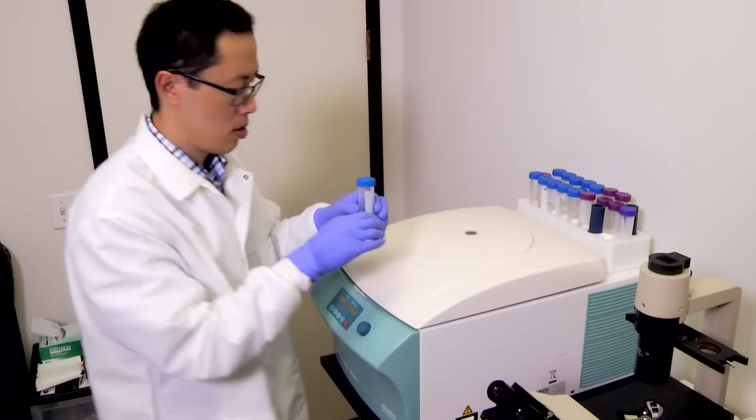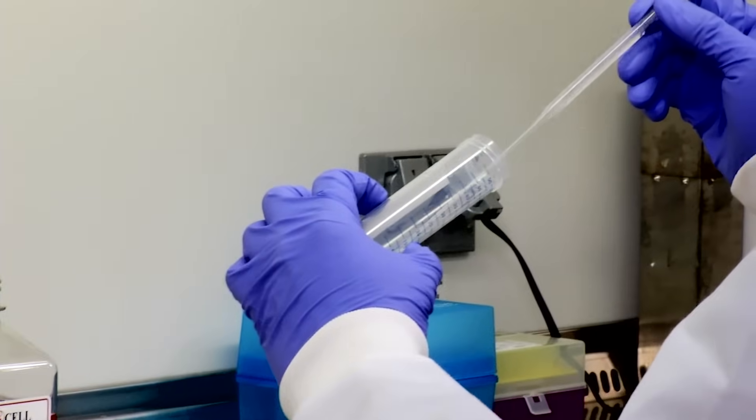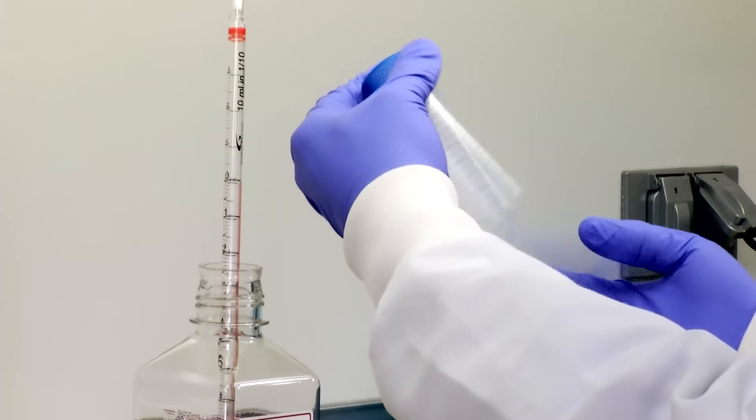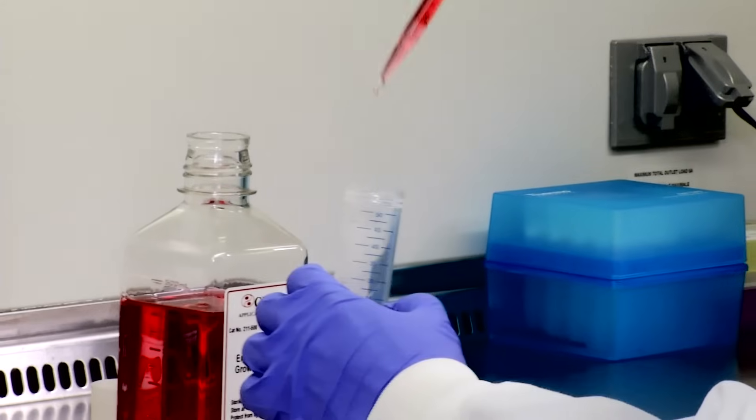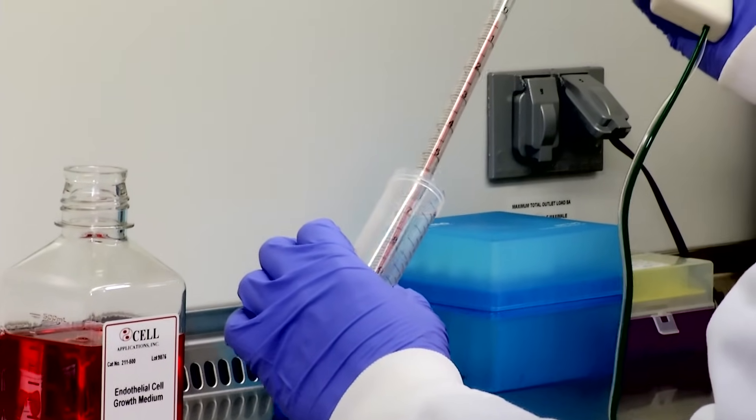Remove tube from centrifuge. Aspirate supernatant without disturbing pellet. Flick tube to loosen pellet. Add 2 ml growth medium and pipette gently to resuspend.